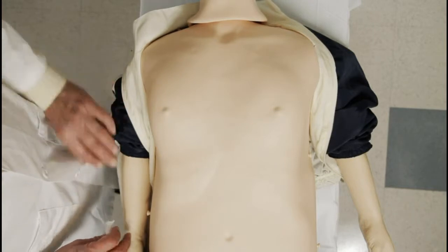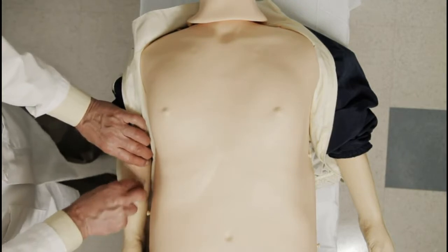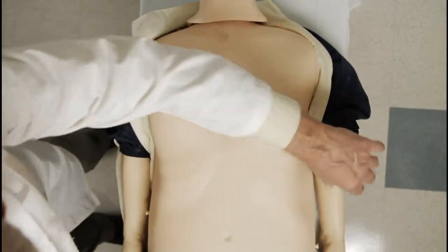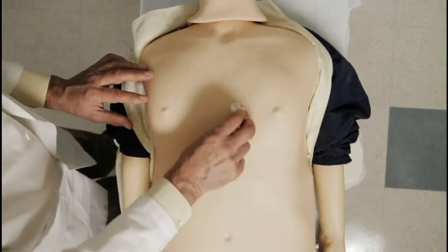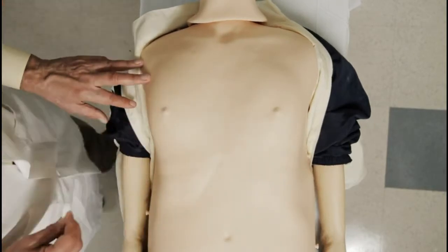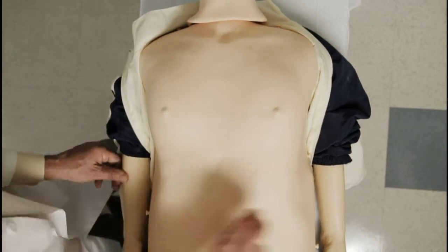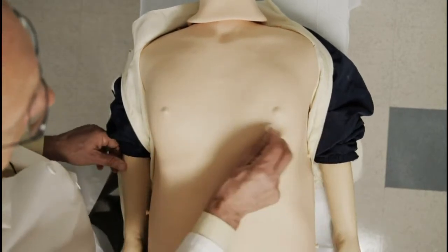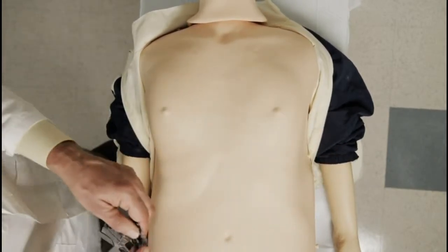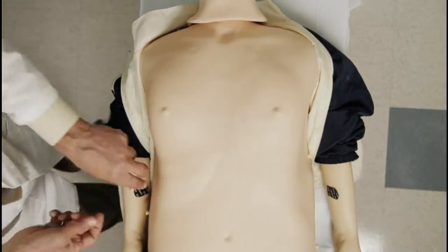The athlete is on a flat, comfortable surface and relaxed with his arms at his side. We'll first wipe the general areas on the inner surface of the arms and of the legs, and then the general areas of the chest with an alcohol pad. Allow it to dry, then take a dry gauze pad and rub the same areas to clear off any oils and dirt to improve the transmission of the ECG signal. Then place the electrodes on the inner surface of the arms and of the legs.